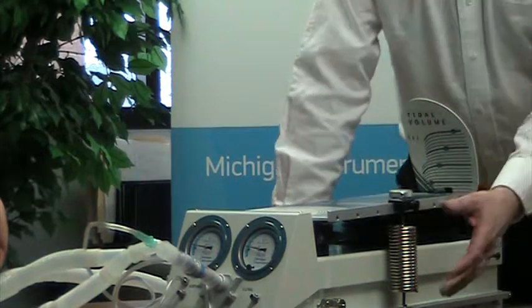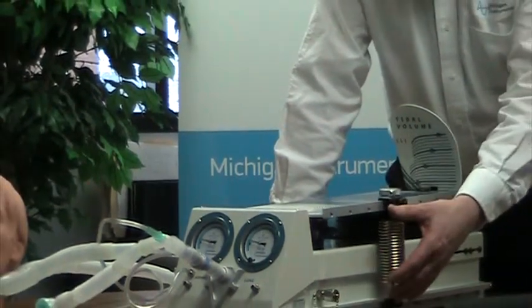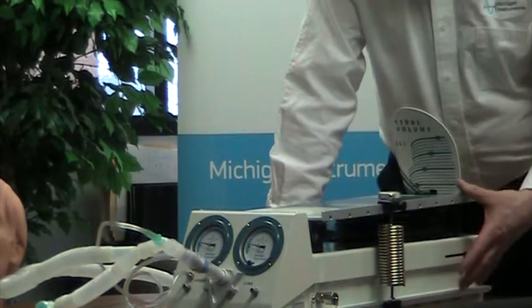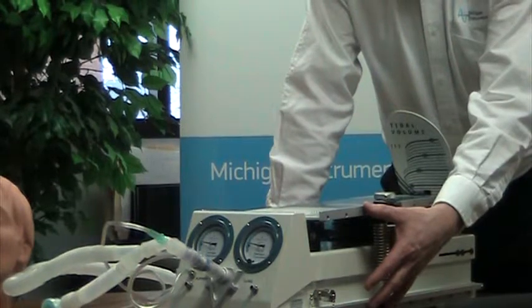They also incorporate a compliance spring. The compliance is adjustable from very stiff to very compliant lungs, so you can simulate both healthy and diseased lung conditions.